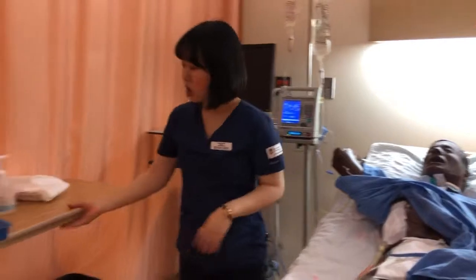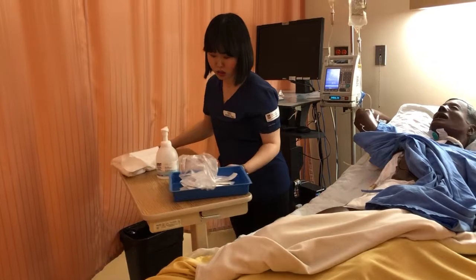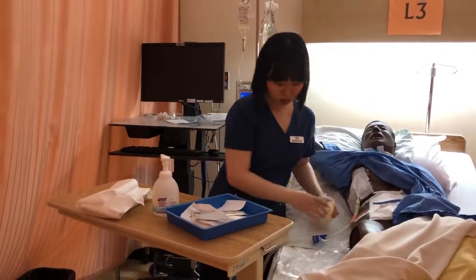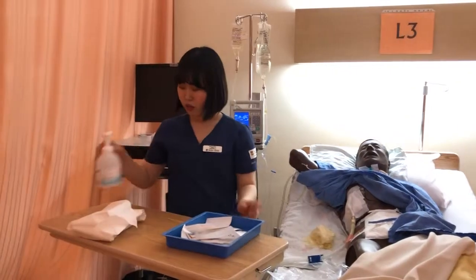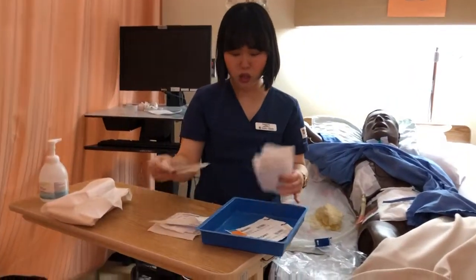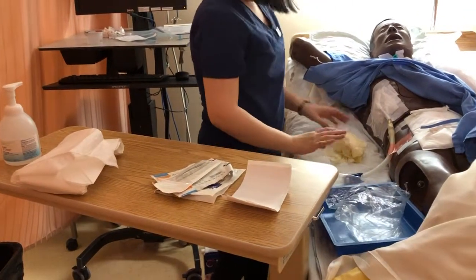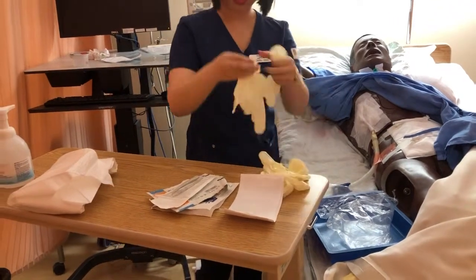So I'm just going to change the dressing. I'm going to put the garbage bag here. I'm going to do my hand hygiene. I grab my supplies here. I have dressing sponges, diluent, and extra forceps, and the mepifix. Is it okay for me to use your bedside? Making sure I'm not hovering over the sterile field.